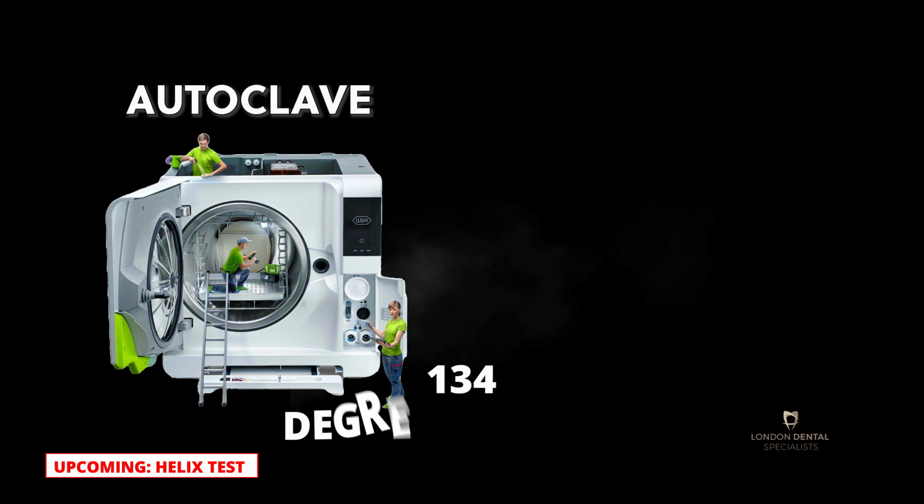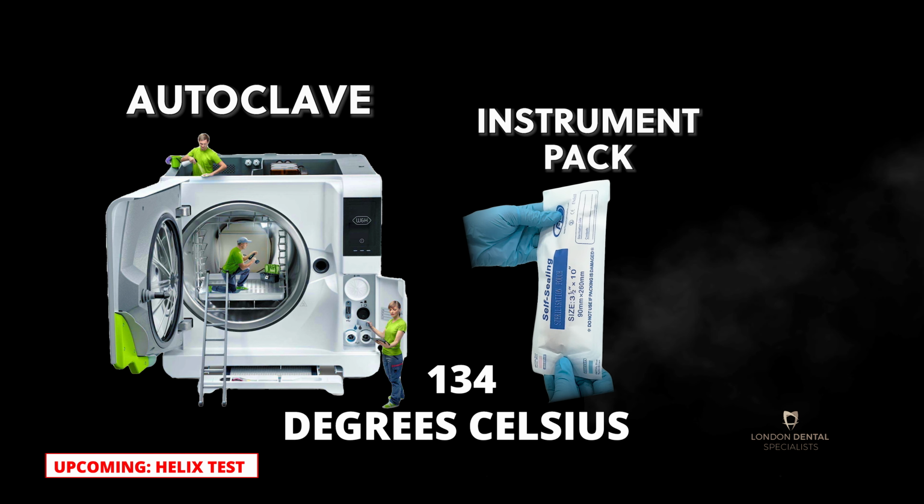We look on the screen here and we can see that the cycle is completed. The vacuum test has been completed. There's a green tick there to show that the cycle was successful, and that means that this machine is able to create a vacuum inside the pouches that are used to protect our instruments. And there's a separate test that I will show you in a second that is done every morning that actually shows that the machine itself is able to push steam at 134 degrees Celsius into our instrument packs to ensure that a sterile environment is created inside those instrument packs.